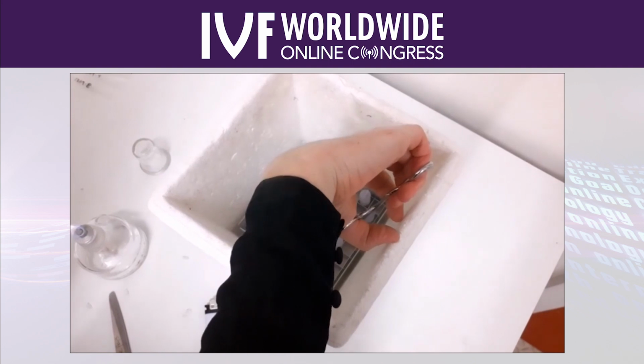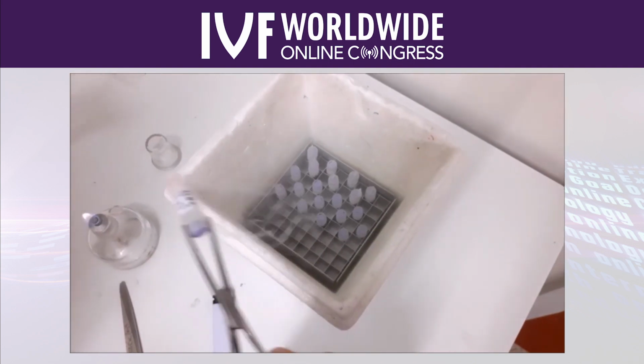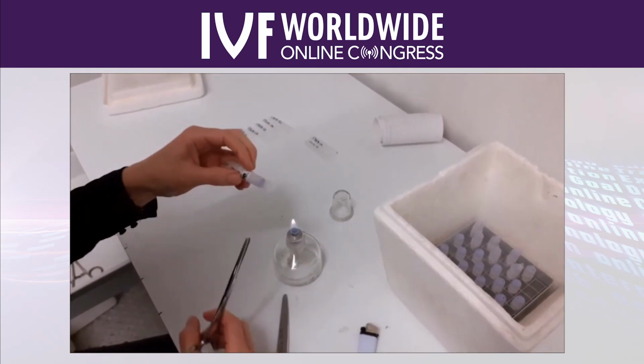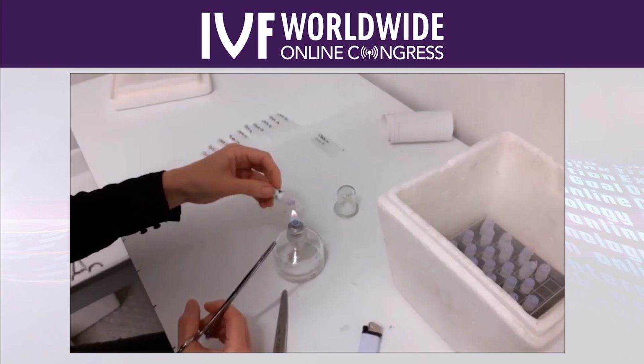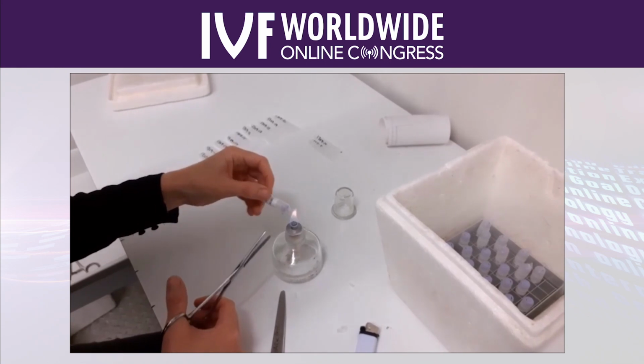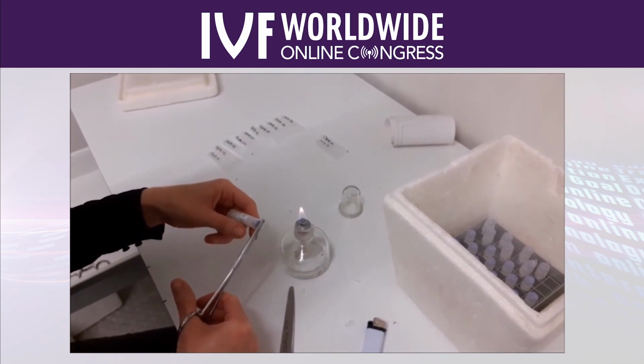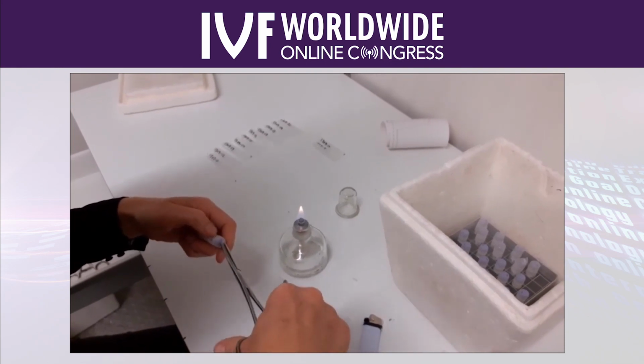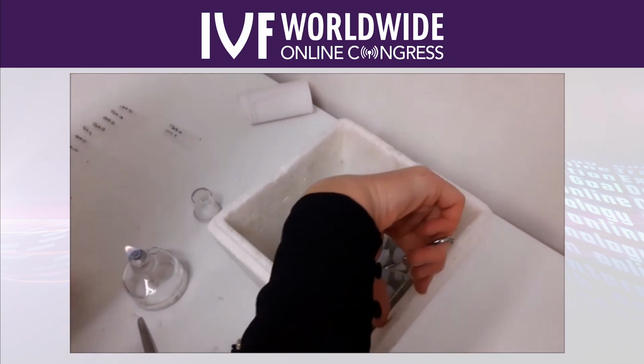After the freezing, about 2 hours later, we take the ampules and do a double sealing, because these tubes are going into liquid nitrogen for long time storage, and to avoid any potential contamination, we do this CryoFlex double sealing of the samples before we put them into storage.